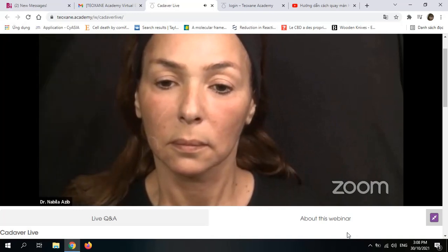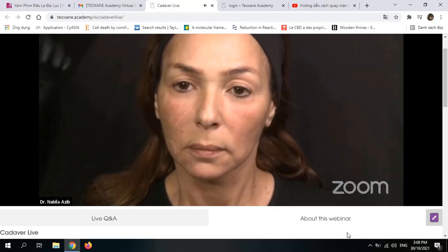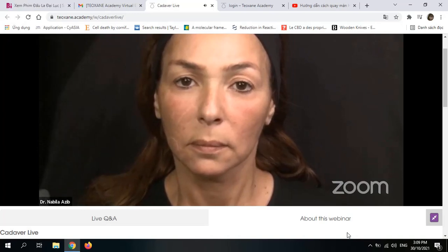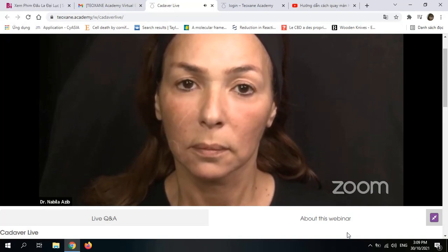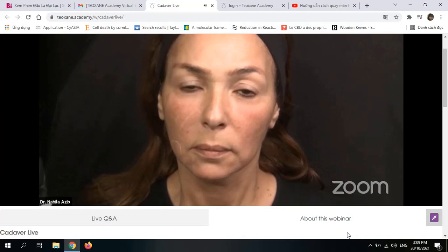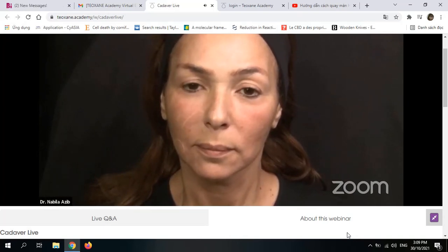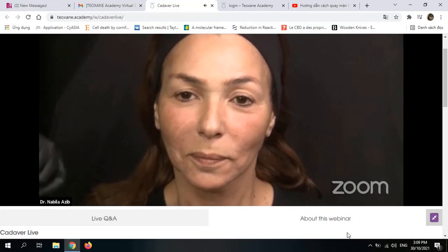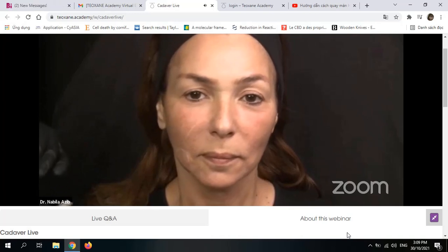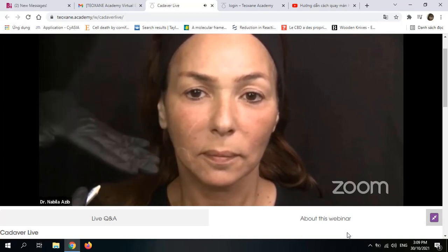Now, it's also about emotions. So we need to see her and to see her emotion before and to see the disappearing of the shadowing that will lead to a better look, a refreshed look, and you will see that the patient will look less tired. So my target today is to play with the balance of shadows and light on the 3/4 of her face.